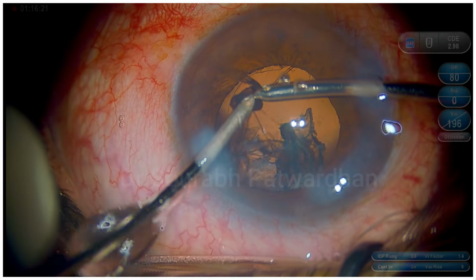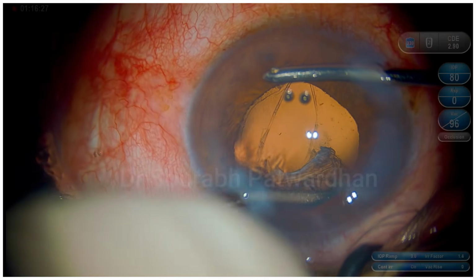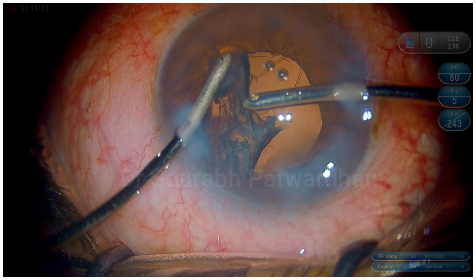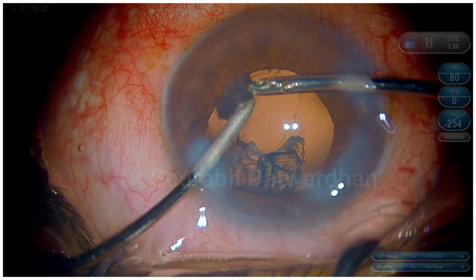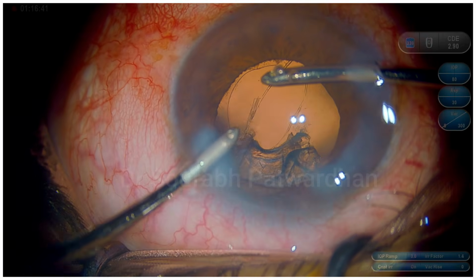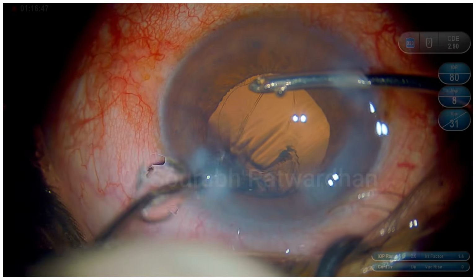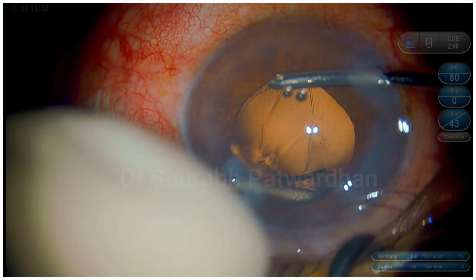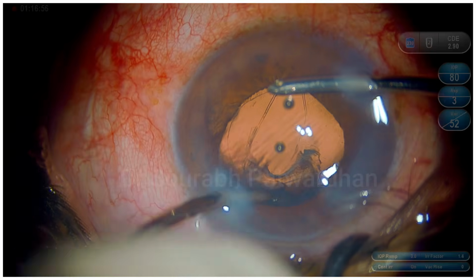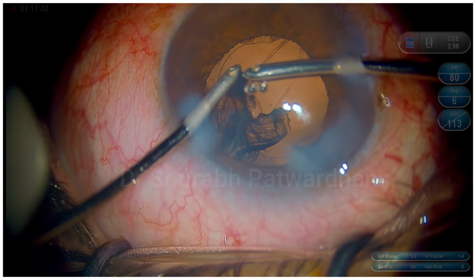Here I am sure that vitreous is not there, and you will find that using the bimanual I/A is less traumatic to the anterior capsular margin, and you are also more confident to take out all the cortex which is remnant. Now in the area of posterior capsular rupture, you have to be more careful with I/A there, because it can pull out some vitreous. So just be careful that you are not pulling on any vitreous strands there.